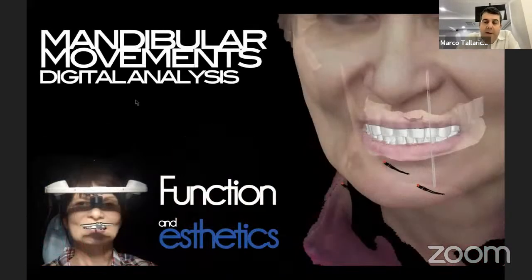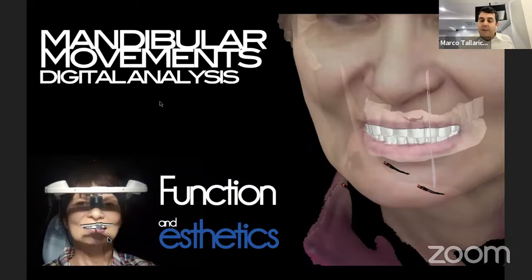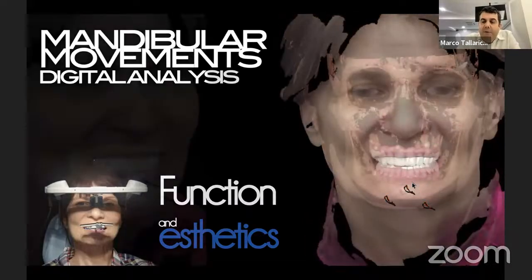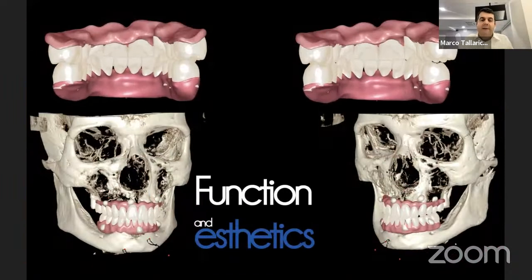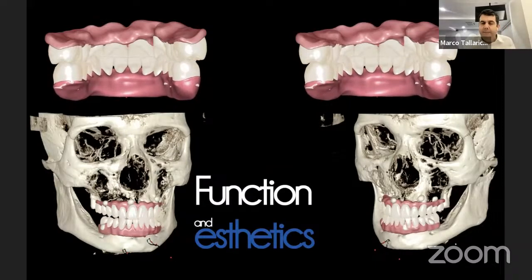Once again, the movements with the new prototype. So I have the movements at the beginning and the movements with the prototype, and I can check and adjust again. This is the anterior guidance before you see the lateral. Again, the protrusion. So here you can see that I can simulate all the movements using the acquisition of the DICOM data, acquisition of the intraoral scanner, just with Smile Creator to create a virtual workup and print the model. In this case, I also use the digital mandibular movements, but you can test in the patient's mouth with the prototype.